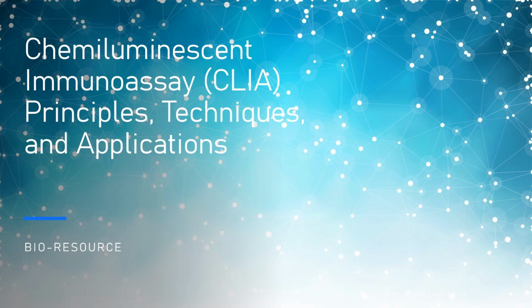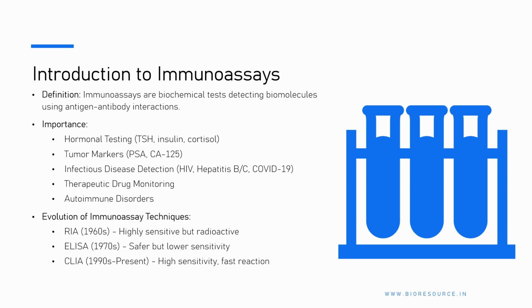Today we are diving deep into the fascinating world of chemiluminescent immunoassay, CLIA, a highly sensitive and widely used diagnostic technique in clinical and research laboratories. This session will help you understand the principles, techniques and the applications of CLIA. So let's get started. Before we dive into CLIA, let's understand what an immunoassay is.